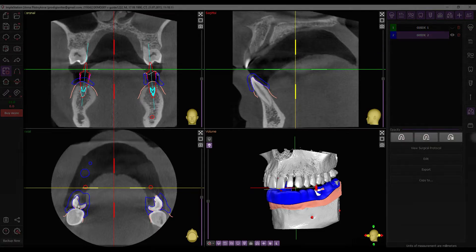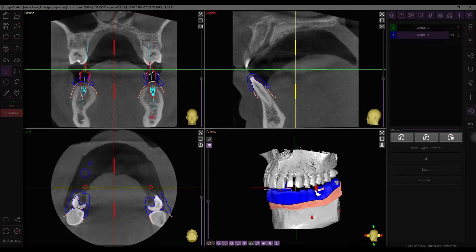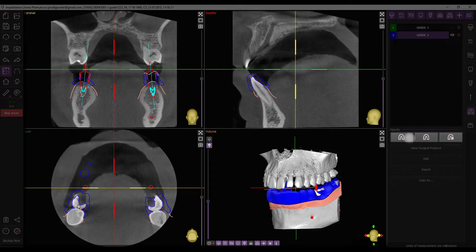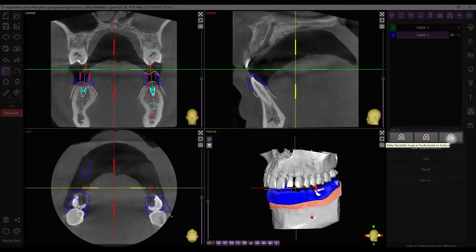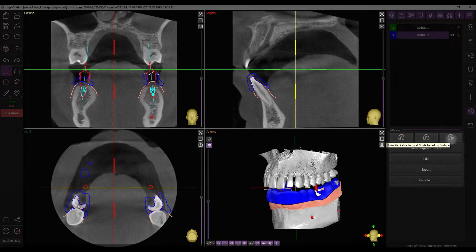The next elements are guide generation buttons for initiating the generation of guides based on surface, prosthesis, and stackable guides wizard. And at last, operational buttons for created guides.